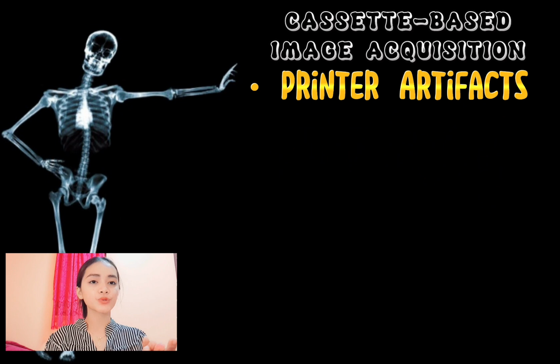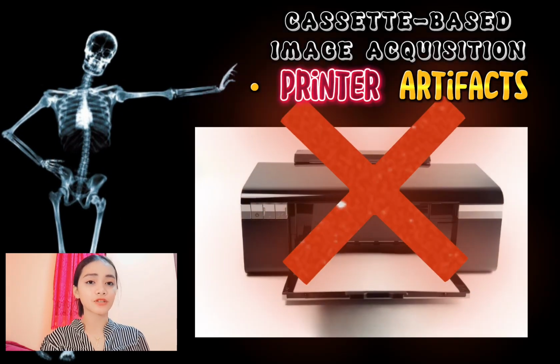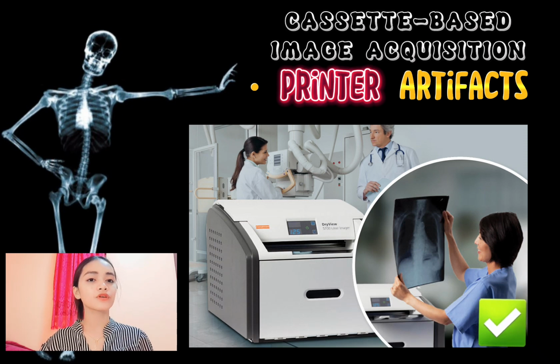So let's separate the two words first. So, printer. Remember, this is not a printer that can be connected to a computer to make copies on paper documents or anything else. The printer we will use is an X-ray printer with laser imagery technology that generates X-ray film from digital data material.